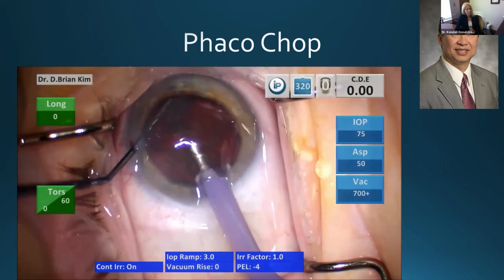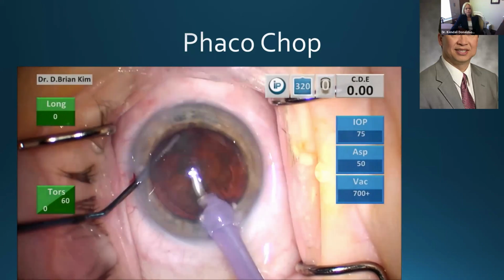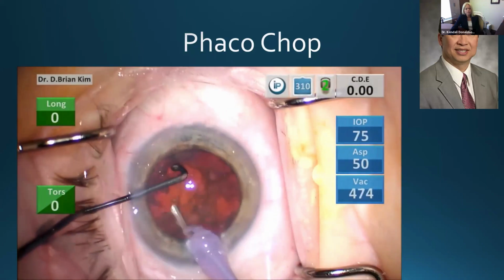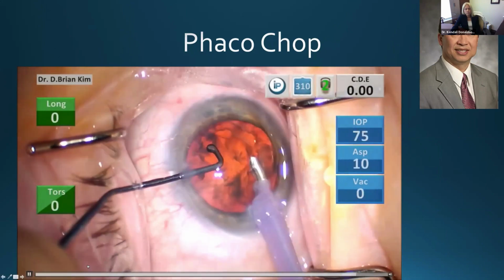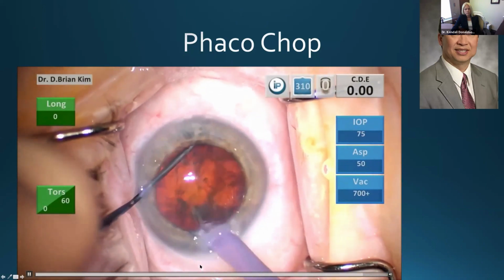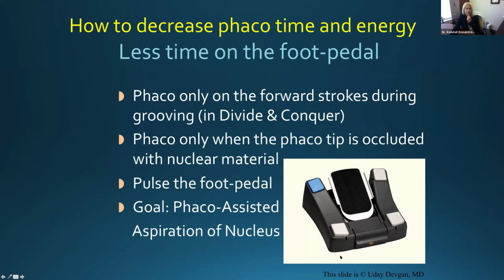Again, I pronated my hand, I went out underneath the anterior capsule to the equator, and then I supinated. I'm going to do that again. After I clean up this epinuclear material with the phaco, again, pronated, slide it past the anterior capsule, supinated, the chopper tip again within the anterior. Okay, so let's move on in the interest of time.